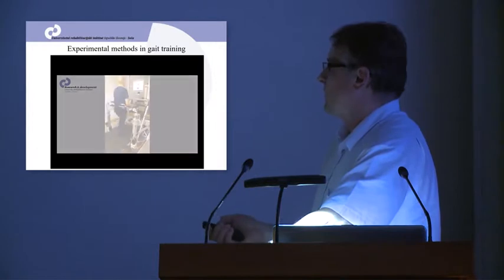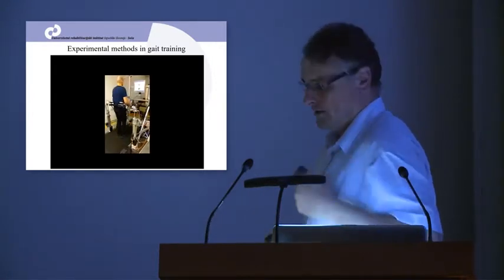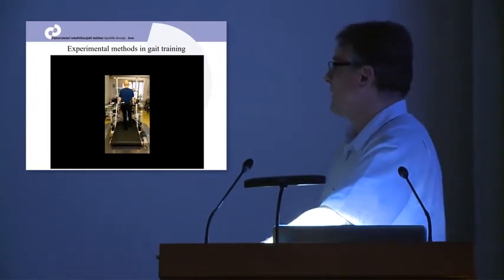So here we have the third patient, who is also doing the symmetry training, and then the perturbation training.